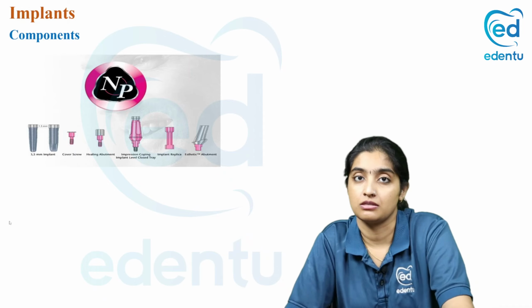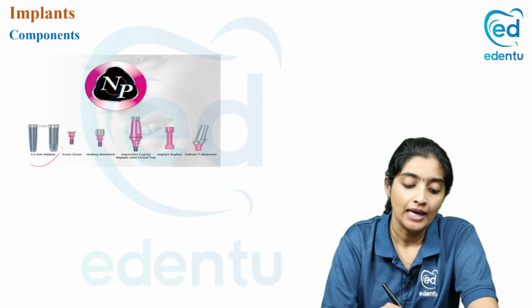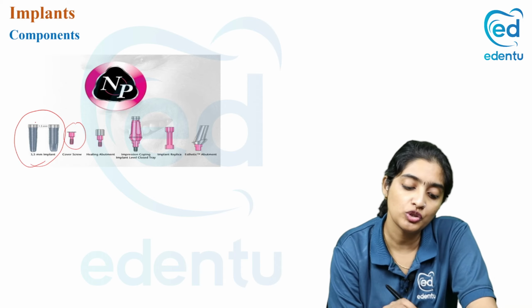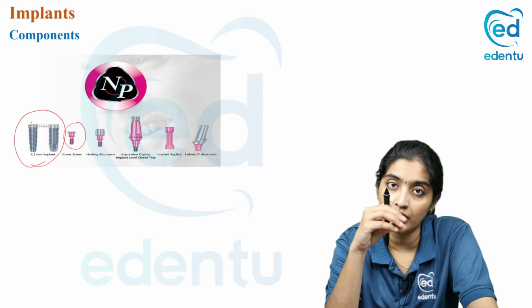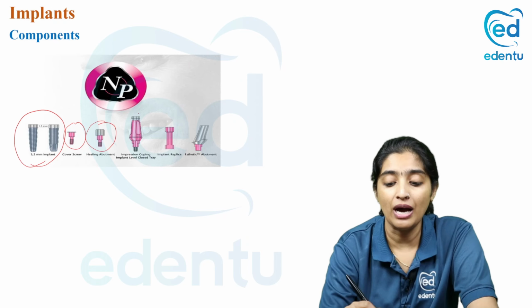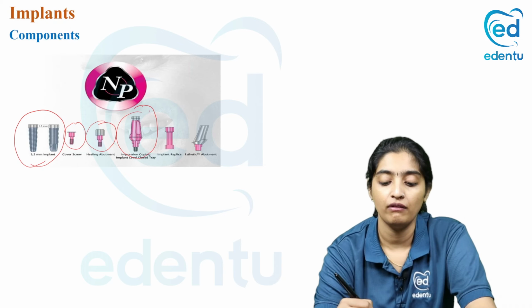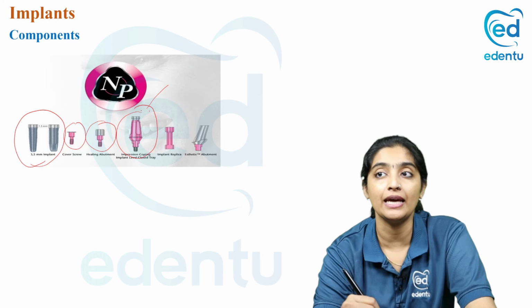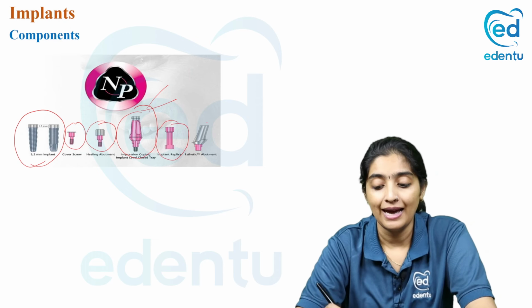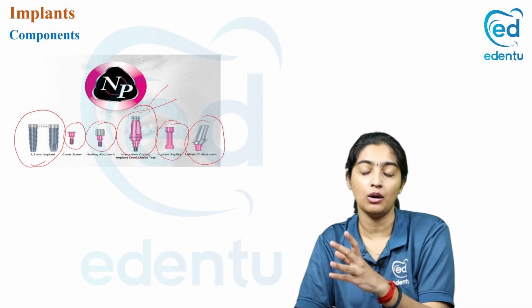Coming to the components, what are all the components that you have in an implant? You have the implant body or fixture. You have a cover screw, which is like a small cap or covering for your implant fixture. You have a healing abutment. You have an impression coping. Impression coping can be of two types: a closed tray impression coping and an open tray impression coping. You have something called an implant replica, and then you have an abutment. Now, I will be explaining each of the components and how it is used.